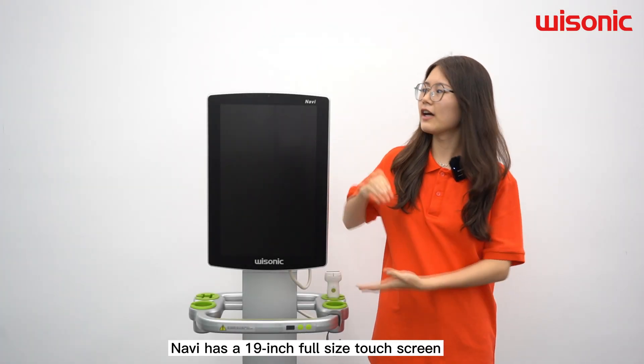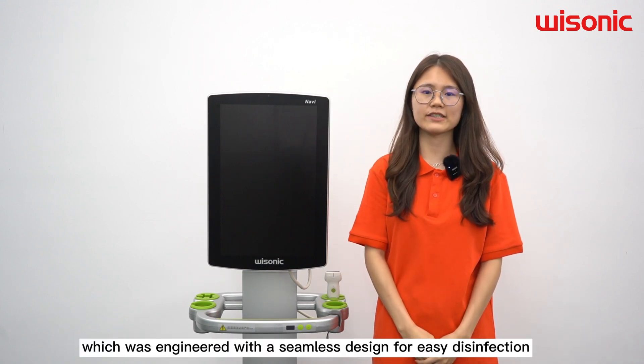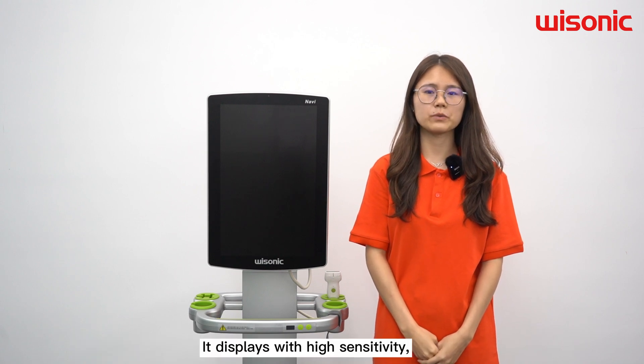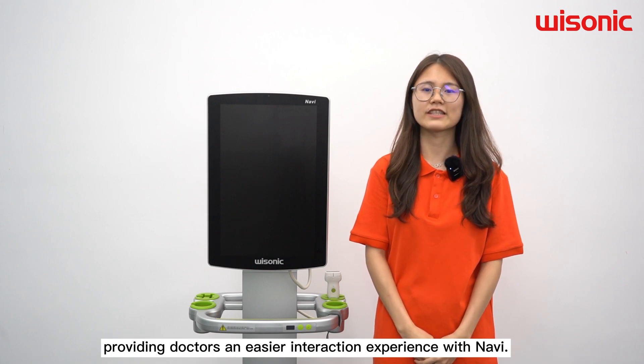Navi has a 19-inch full-size touchscreen, which was engineered with a seamless design for easy disinfection. It is equipped with high sensitivity, providing doctors with an intuitive interaction experience with Navi.